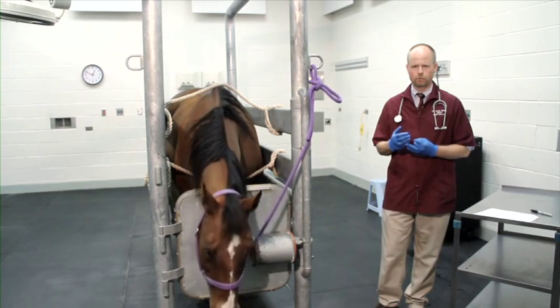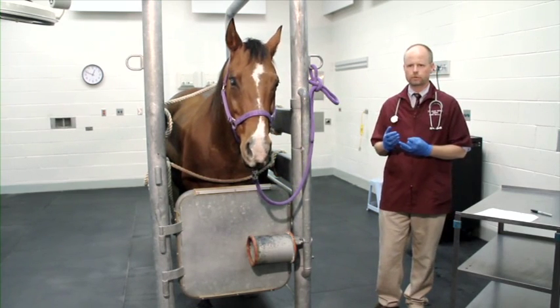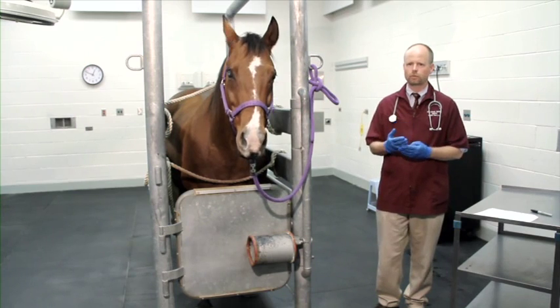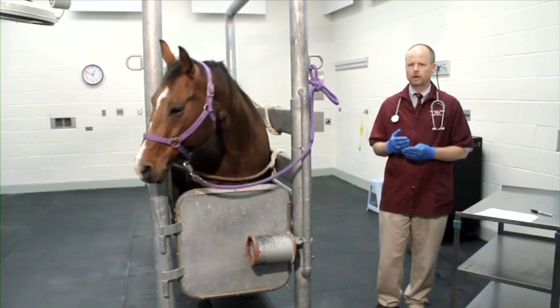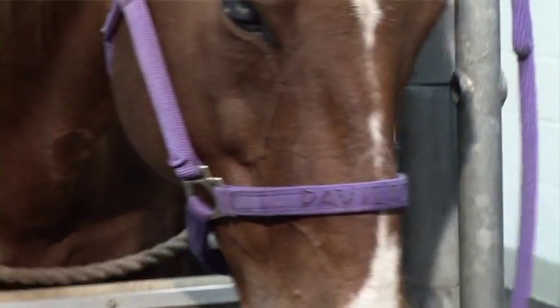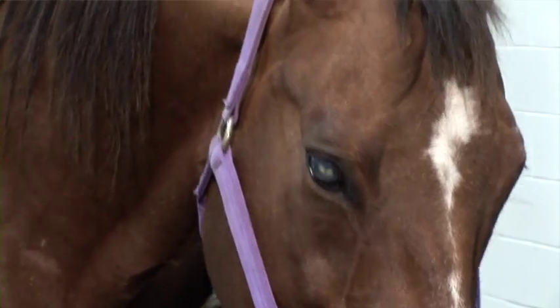We like to take the horse's temperature rectally and confirm normal body temperature. We will generally estimate the horse's body weight, estimate the body condition score, and go through the components of the exam. Once it's been determined that everything looks good, we feel it's safe to administer the medications to the horse.